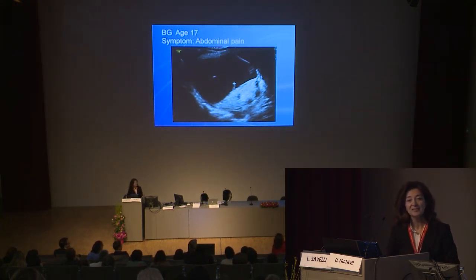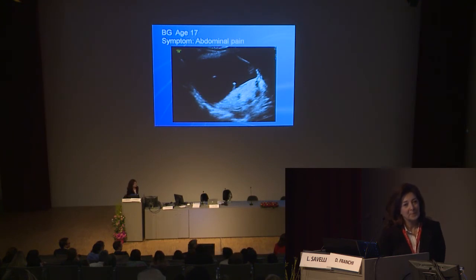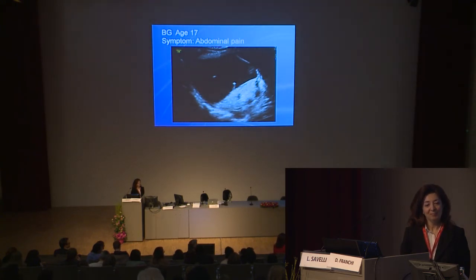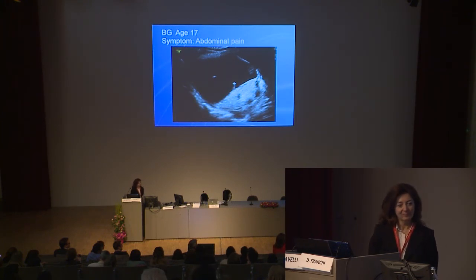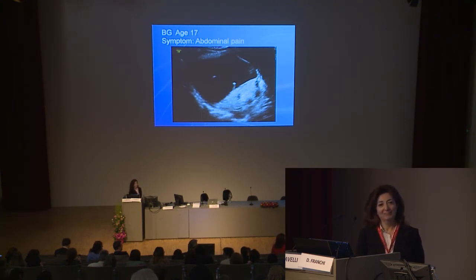Go on? Sorry to interrupt you, but just to give us an example, in your future daily life, if you want to suggest using ADNEX, would you like to tell us your future report? I mean, first you will say, according to my subjective evaluation, it can be an ovarian fibroma. And then how do you continue? But if you look at my graph, there is a suspicion, but how can we use it?